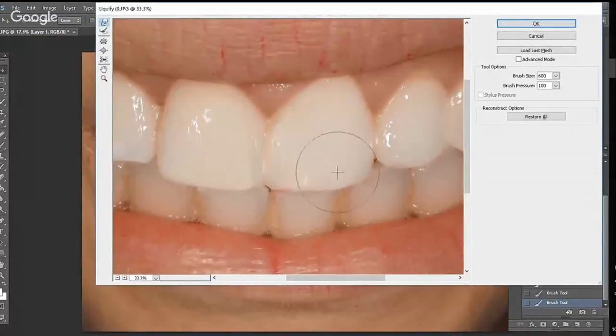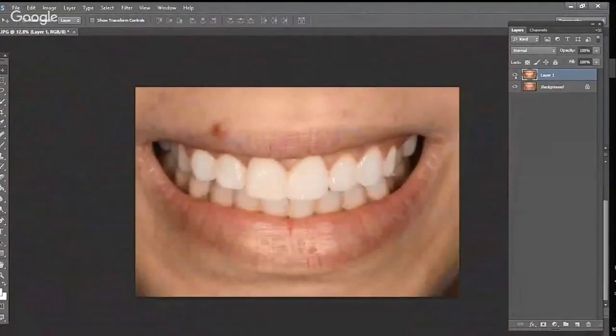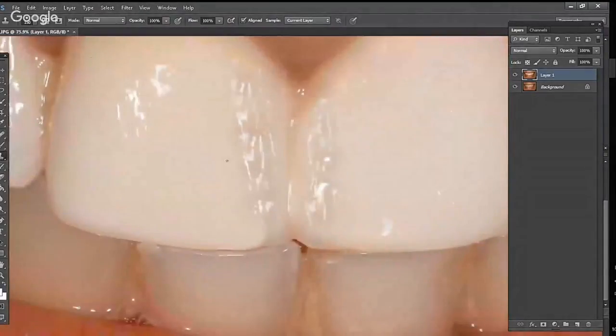But again, the problem with Photoshop is that you get into this software and you will be overwhelmed with the tools that you can see. You cannot choose the tools correctly. So here's the before, after. I then copy some transitional line angles.